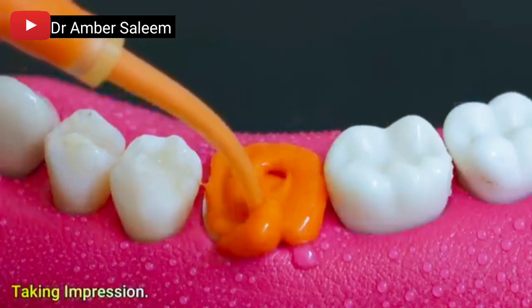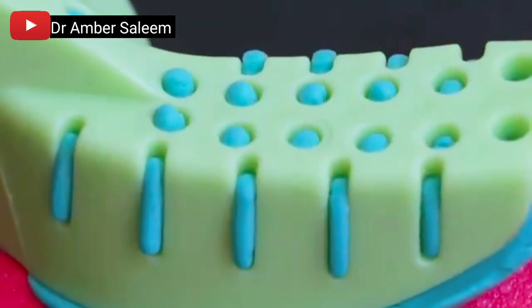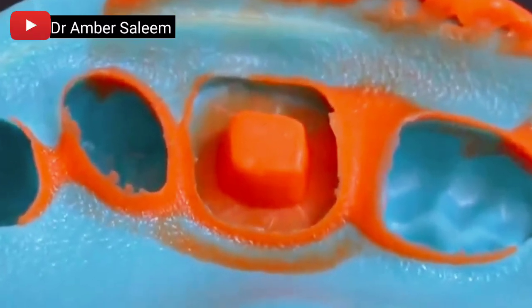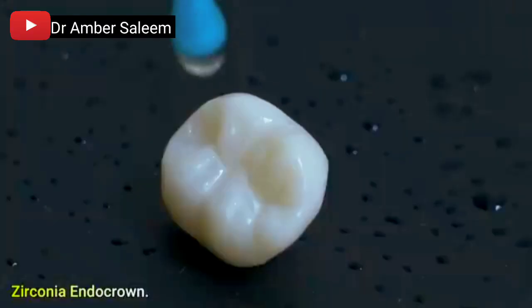Taking an impression for the final restoration. A zirconia endocrown is fabricated based on the impression to provide a durable, aesthetic final crown for the treated tooth.